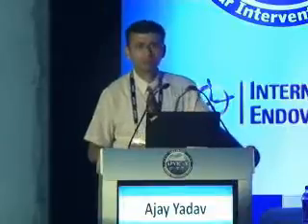We are tackling much more complex cases, much more complex anatomies, smaller device sheaths, hopefully, which are the future. Fenestrated devices, again, the device size is getting bigger. We're trying for daycare or shorter admissions. I think the last 3 aneurysms that we did were practically daycare admissions. Early ambulation, hopefully by evening, especially if you're using percutaneous EVAR. Early discharge, and of course, we're dealing with more and more ruptures.